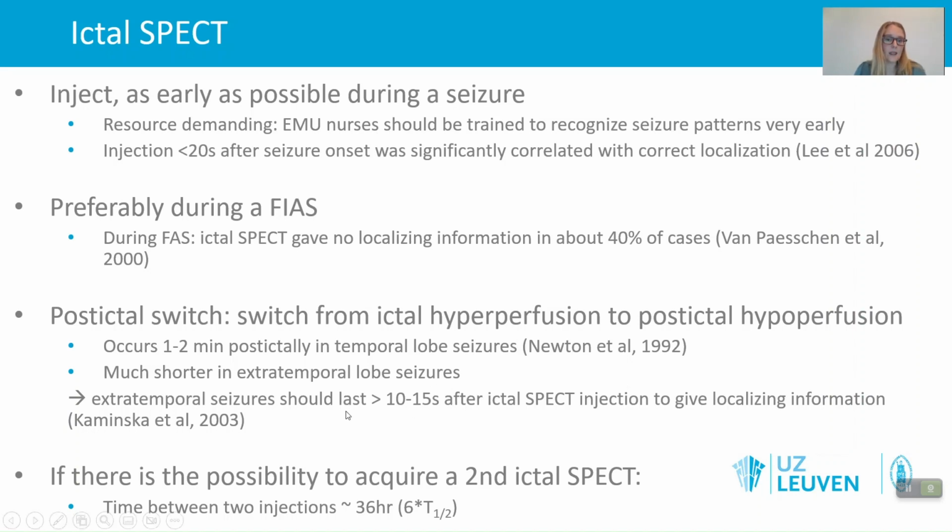But again, like I said before, the moment you detect the seizure and you inject, you have no idea, or you don't know beforehand, how long the seizure will last. But this will be very important in the interpretation of the results later on.